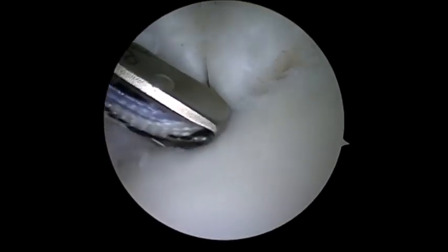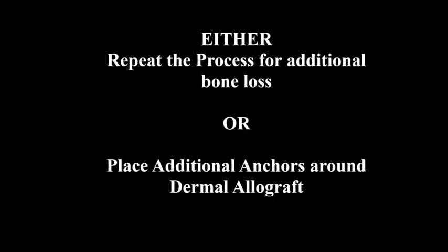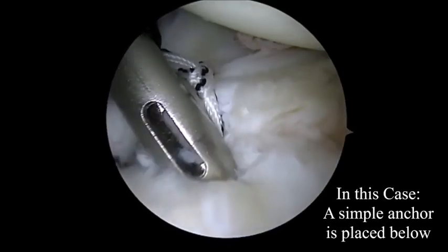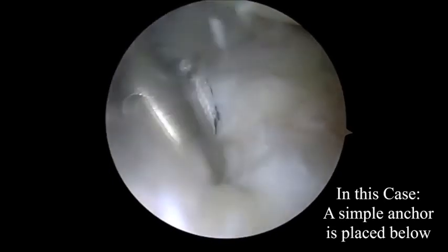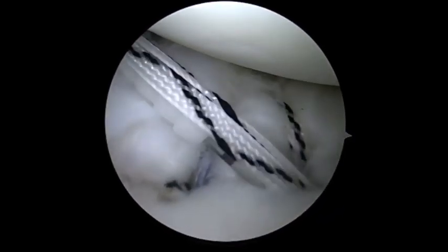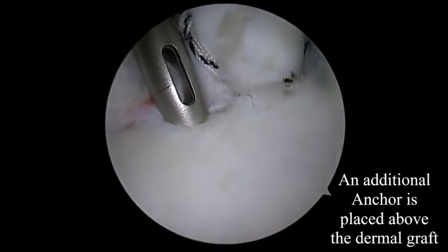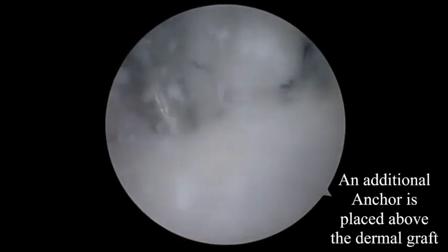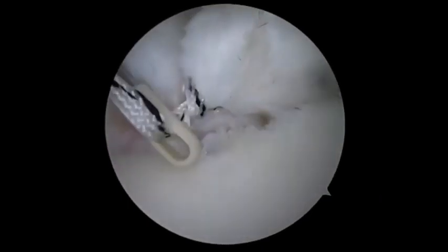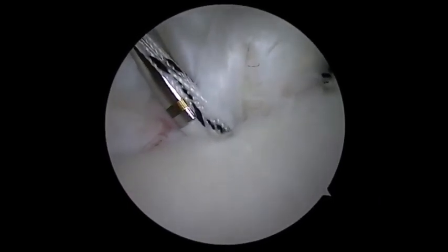At this point, 2 options remain. If additional bony defects remain, the process can be repeated. Otherwise, additional anchors can be placed. In this case, an additional anchor was placed below the dermal allograft in order to provide a capsule shift at the 6 o'clock position. An additional anchor was then placed at the 3 o'clock position in order to close down the capsule superiorly.